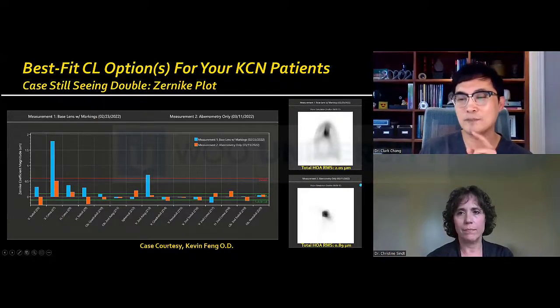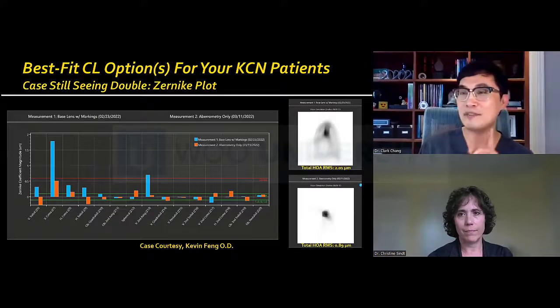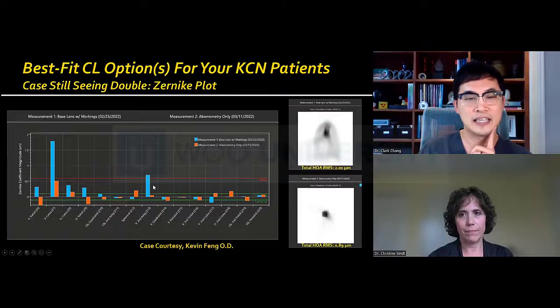And I want to point out that it's very easy to look at that E and say, that's still not a good E. That still looks like you should see a lot of shadow and ghosting. Is there not anything else that you could do? I would say if the patient had complained, it's much better, but I still see a little bit of that ghosting halo, I would then try to more aggressively hit it, depending on the direction and the symptom the patient described.